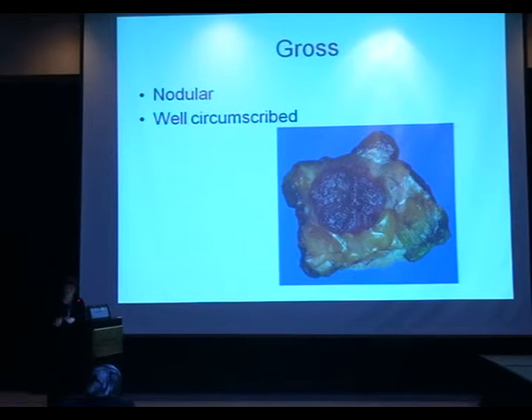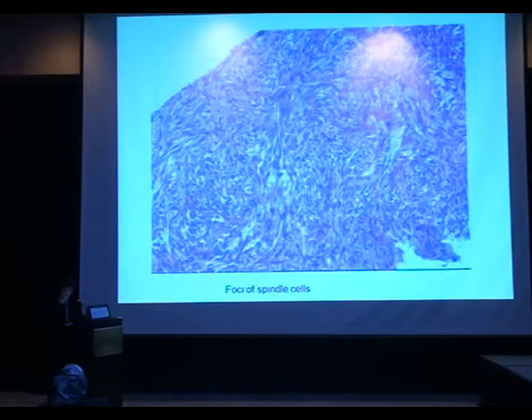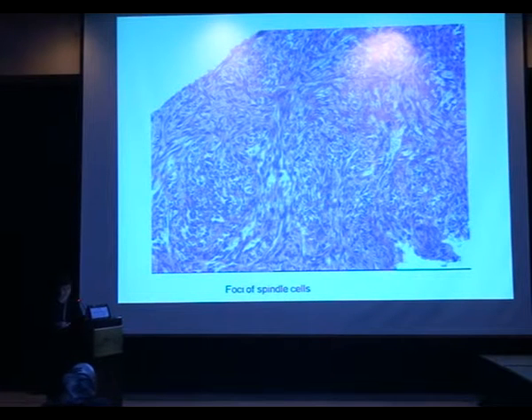Usually the angiosarcomas are secondary angiosarcomas after radiation therapy in the breast or more frequently on the arm in a context of lymphedema. So she had all the characteristics of low-grade angiosarcoma: vascular proliferation, atypia, and mitosis. She has some areas that were less well differentiated, and that's true, but if we were having that on the biopsy and not the other aspect that I showed you, it would have been much more difficult because here it's less differentiated. So that's why you should also try to look if you have some area that could be suggestive, when you see a spindle cell lesion, of a special type of spindle cell lesion.